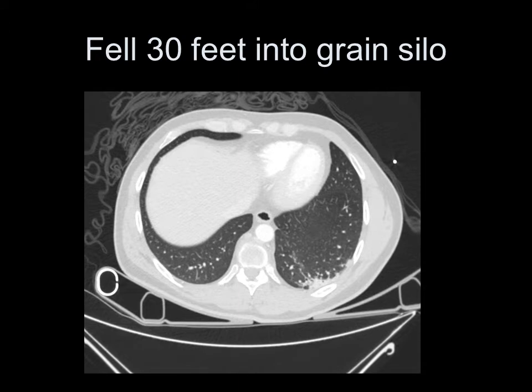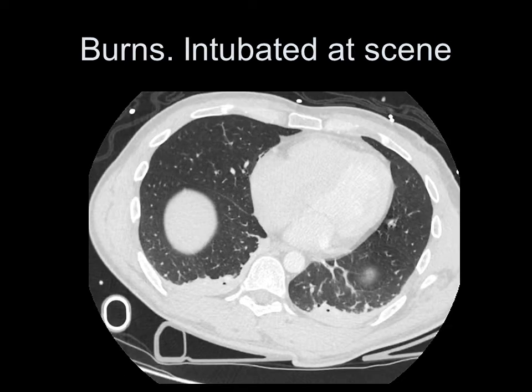Here's a patient who fell into a grain silo and this was called consolidation, but I wonder if the reporter was under some pressure to do so. There were no associated fractures. The air bronchograms here look quite clustered, and I'm thinking this is more an area of atelectasis, though I admit it's quite difficult.